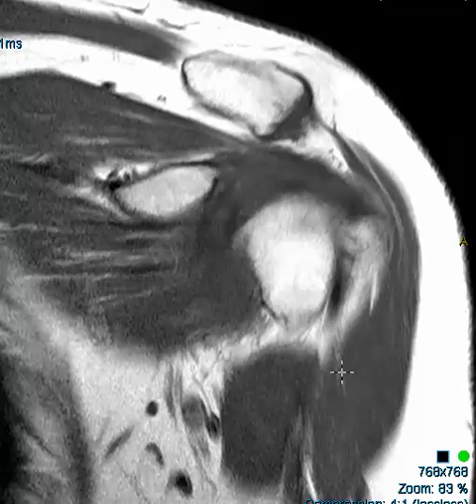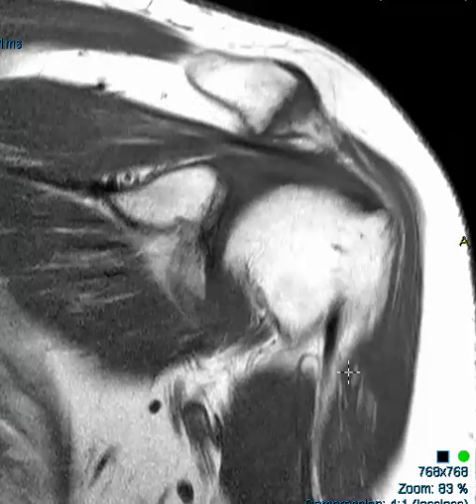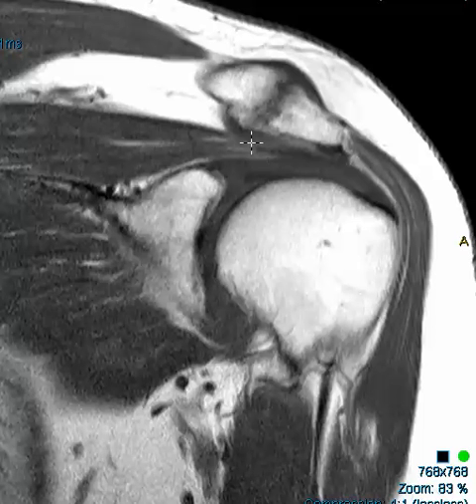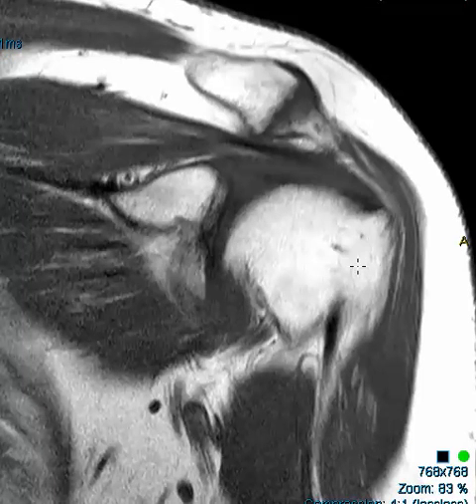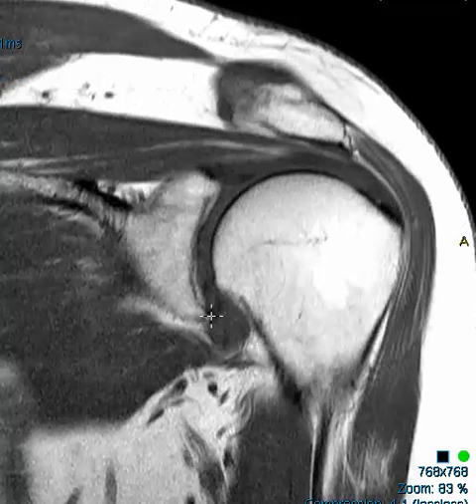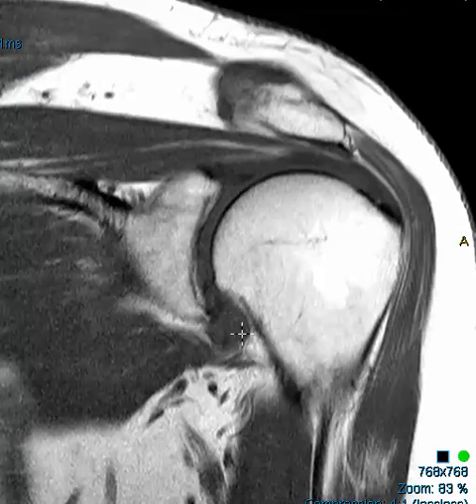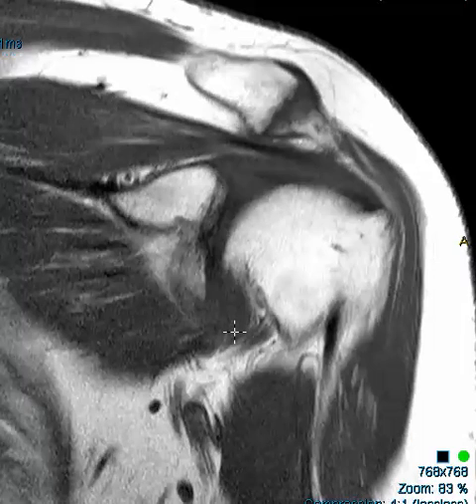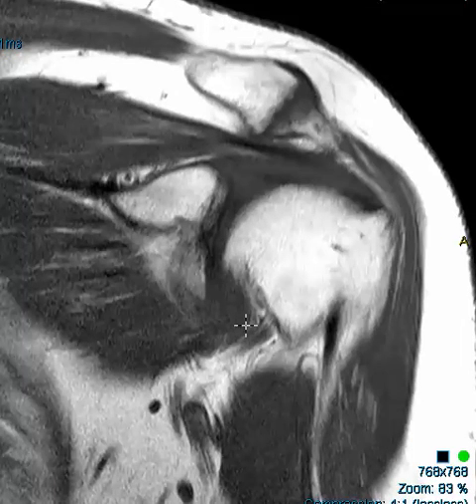Hello, this is Dr. Gay from Forsyth MRI. This is a 60-year-old male with shoulder pain and no history of trauma. There is some tendinopathy of the rotator cuff, some AC arthropathy, and several other findings. One finding relates to the joint capsule — down in the inferior joint capsule it looked pretty thick and was bright on the T2-weighted sequence, so I was thinking about adhesive capsulitis.